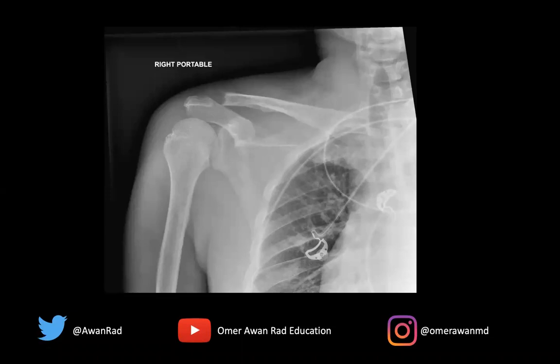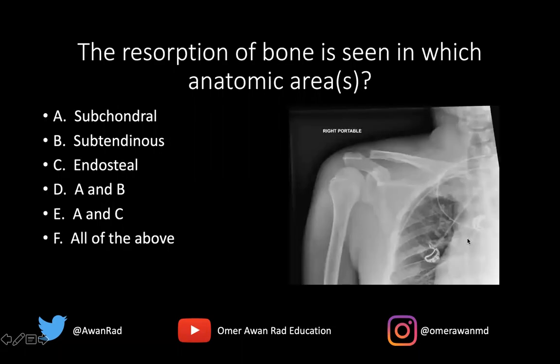Hello everyone, and welcome to MSK Unknown Case Series, case number 42. Here we have an interesting frontal view of the right shoulder, and I'll give you a second to ponder what you think the findings are. The question here is: the resorption of bone is seen in which anatomic area or areas? Is it subchondral, subtendinous, endosteal, A and B, A and C, or all of the above? I've purposely given you a lot of choices because I want you to really nail down exactly what this is.